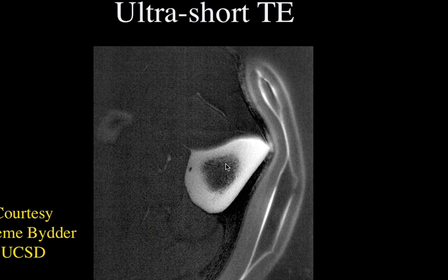It turns out there's a certain amount of energy deposition into the tissues which will typically limit the core temperature rise to less than 1 degree centigrade. And that's basically more or less what the FDA has used as their limitation for SAR exposure. So by using send receive coils, we can put in much more local energy to that area without risking an elevation of the core body temperature. So that's what we usually use. In this case, I think the send coil was the body coil, and this was just a receive only coil.